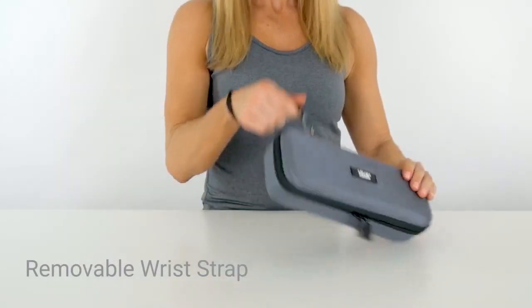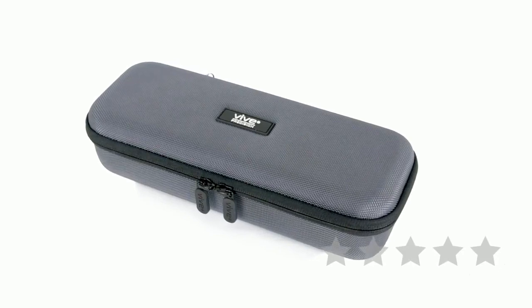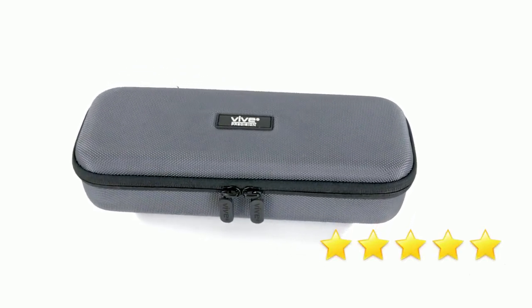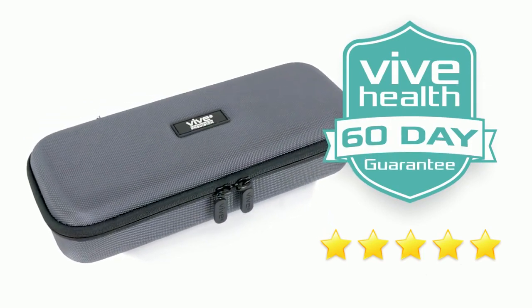A removable wrist strap provides convenient portability. The stethoscope case by Vive Precision is trusted and proven — check out the five-star reviews. Plus, it's backed by an unconditional 60-day guarantee. You can't beat that anywhere.